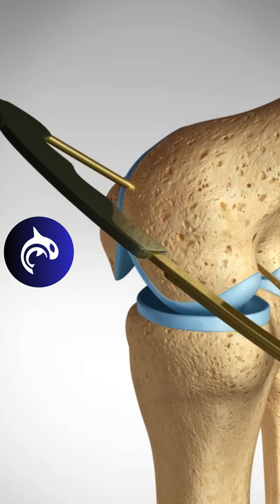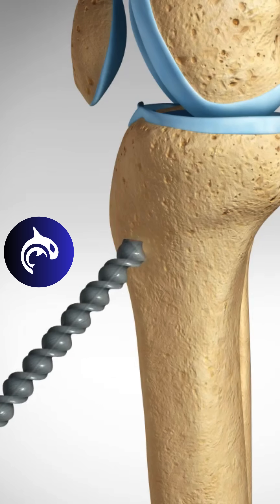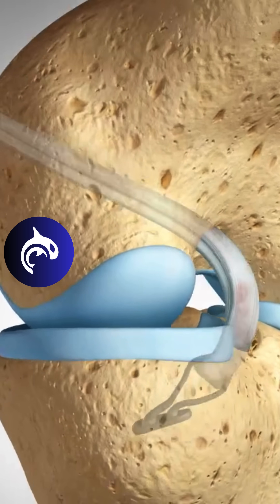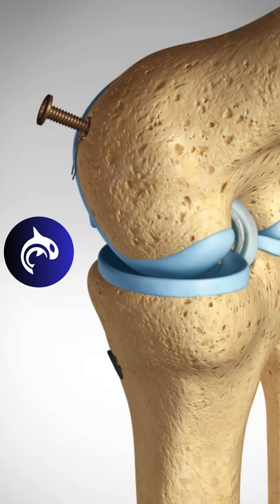Like the patella tendon technique, tunnels will be carefully drilled into the femur as well as the shin bone, or tibia. The hamstring graft is then secured using screws or suspensory fixation. Over time, the tendon transforms into a strong, functional ligament, restoring knee stability.